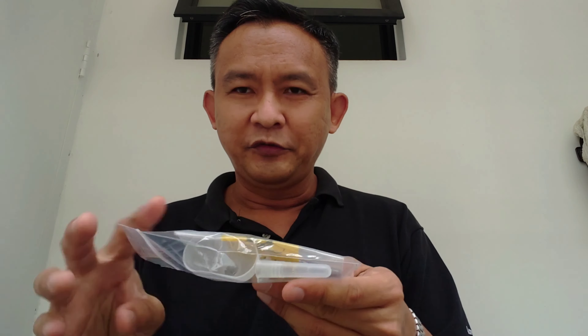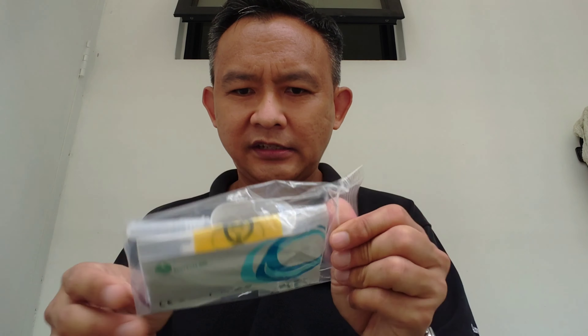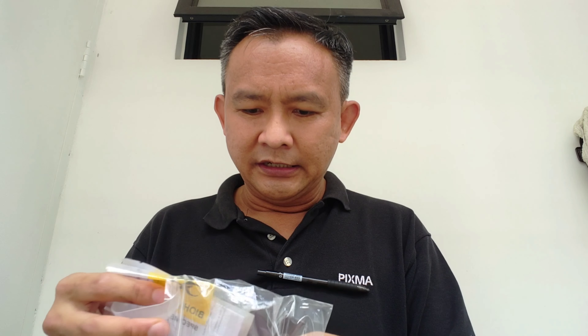Hello guys! So now you know that you have to do this kind of saliva test to make sure that you don't have COVID. But how do we use it? Let's see.